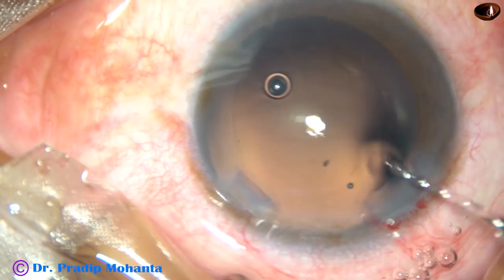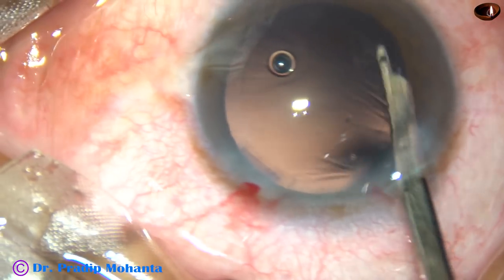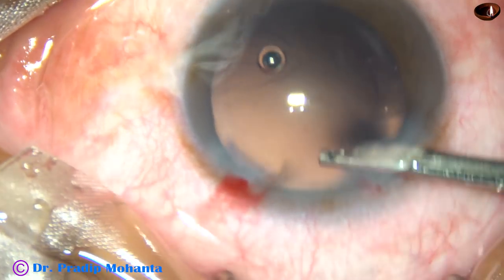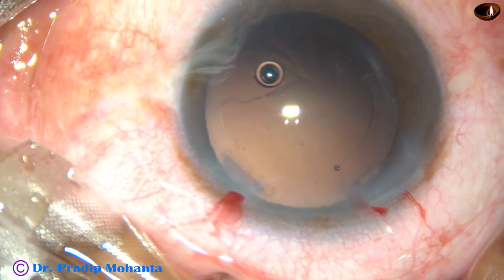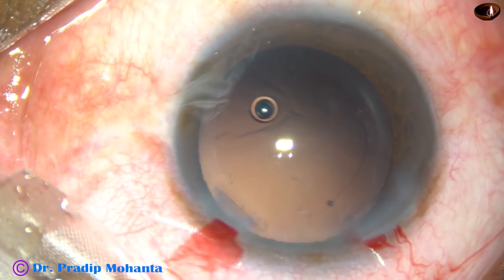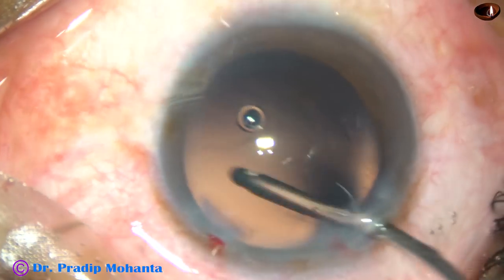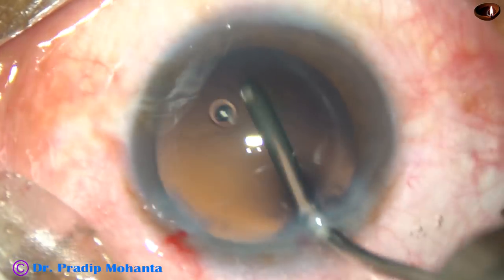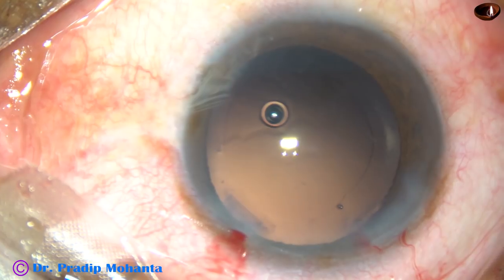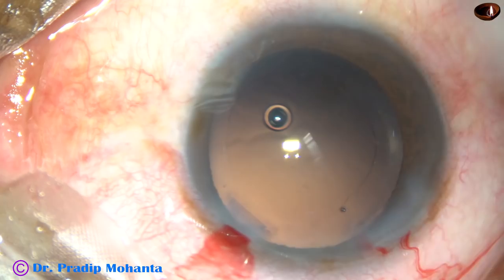And now, a little bit of polishing of the posterior capsule is being done. But this is not the right instrument for polishing. This is a totally unedited surgery. This is the right instrument for polishing the posterior capsule. The fluid jet is being used to dislodge the cells that stick to the posterior capsule.